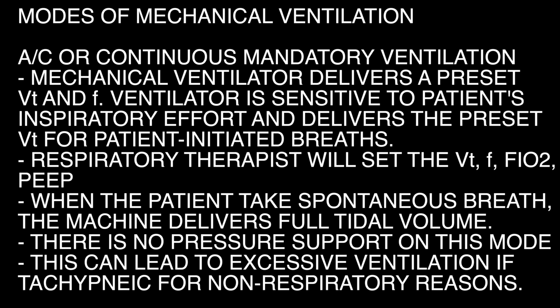Modes of mechanical ventilation. AC, or assist control mandatory ventilation. The mechanical ventilator delivers a preset VT and F. The ventilator is sensitive to the patient's inspiratory effort and delivers the preset VT for patient-initiated breaths.